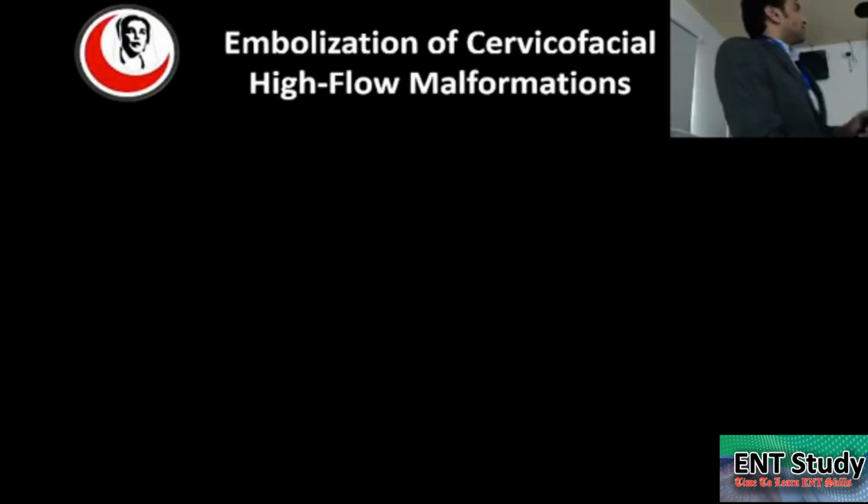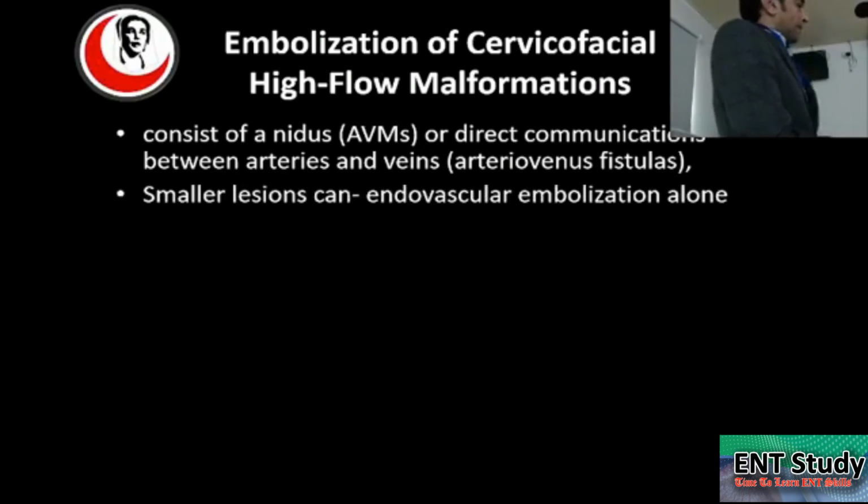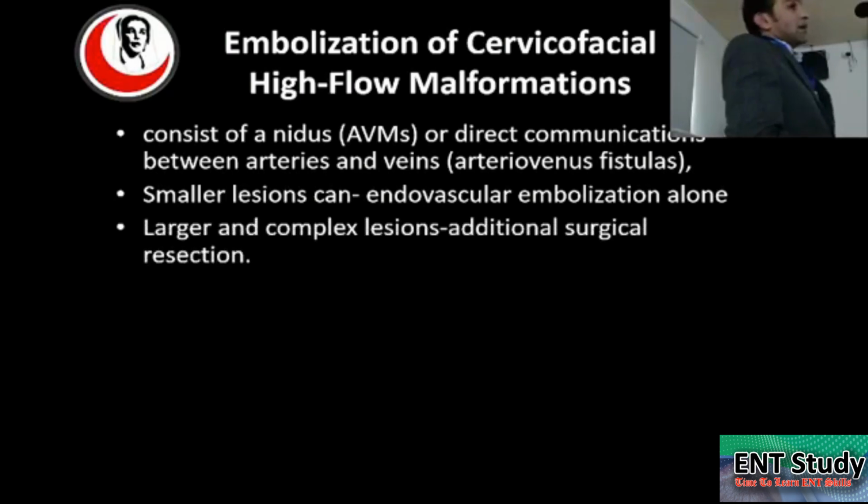Now the embolization of cervicofacial high flow vascular malformations. Angiographically it consists of a nidus or direct communication between the arteries and the veins, that is the fistula. A multidisciplinary team approach is required for the assessment of high flow vascular malformations. Although smaller lesions can be treated by endovascular embolization alone, larger and complex lesions need additional surgical resections.